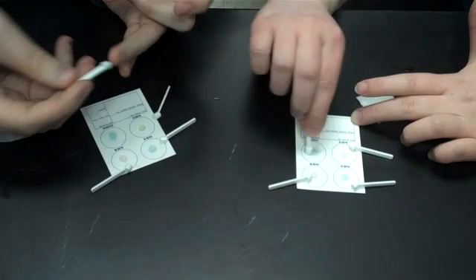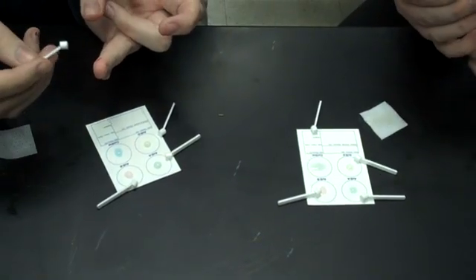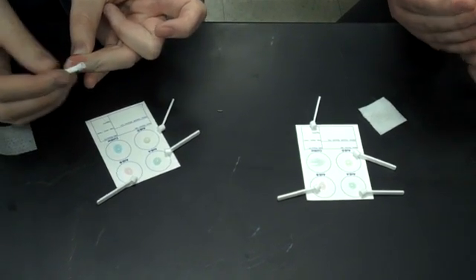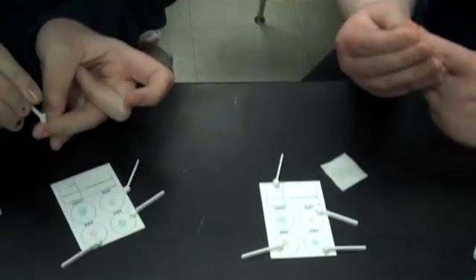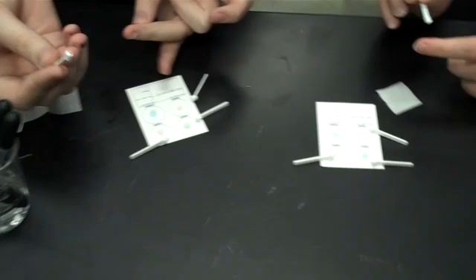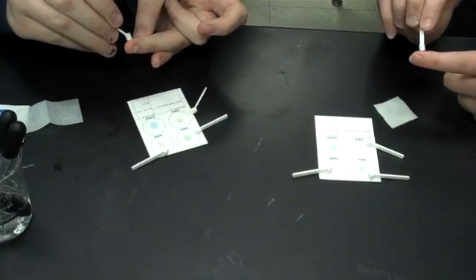Kind of swirl it around a little bit. I don't think you have enough blood there — just massage the finger until more of it flows out. Remember not to mix the sticks in each of the wells. You need almost like a little bubble on top of that stick; it will look like a little bubble in the well.